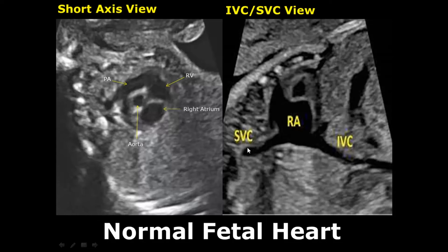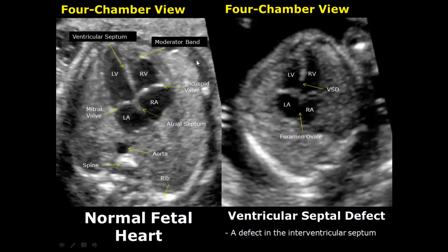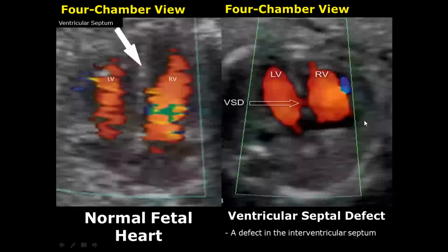In a ventricular septal defect, there will be a hole in the interventricular septum creating a connection between the right and left ventricles. On color Doppler, we can see blood passing through this ventricular septal defect.